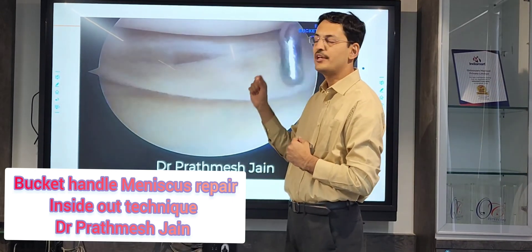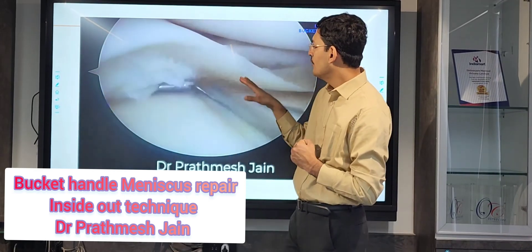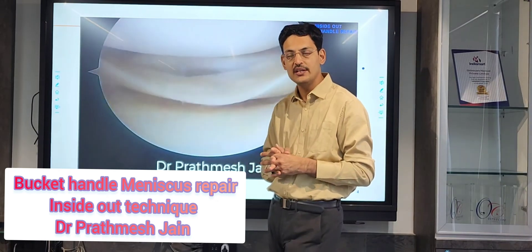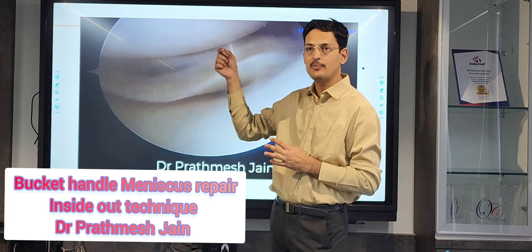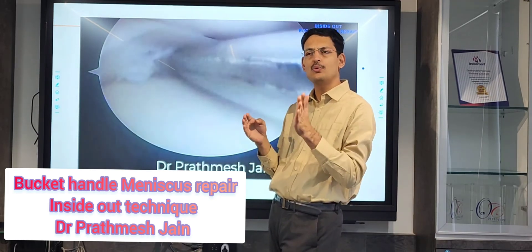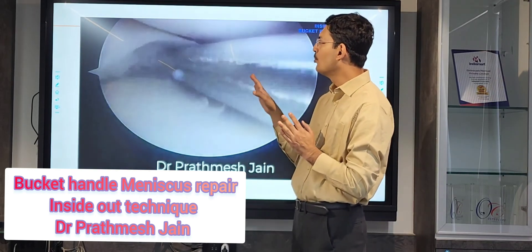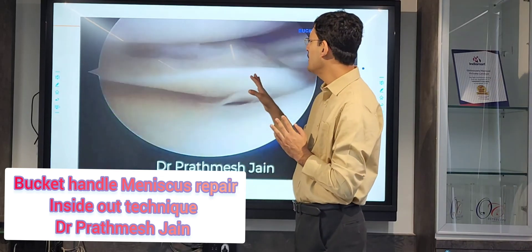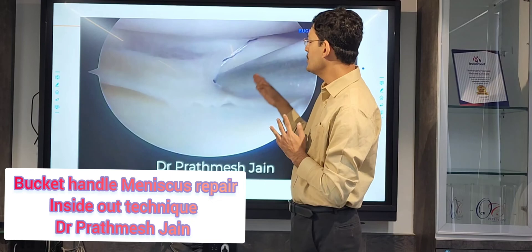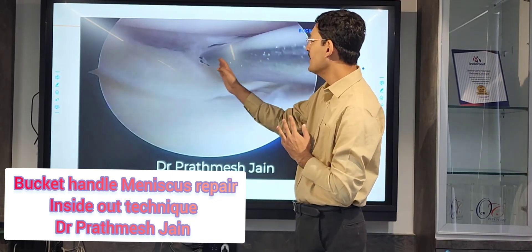The zone-specific repair system makes your needle exit at one particular point. It has different cannula angles: 0°, 10°, 20°, 30°, 40°. Before this step, you should approach the posterior medial aspect of the knee, expose the muscles and tendons, and go up to the level of the capsule. Then use your zone-specific inside-out meniscus repair system to repair the meniscus.